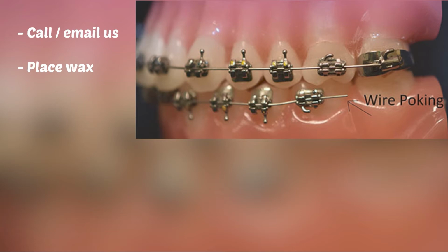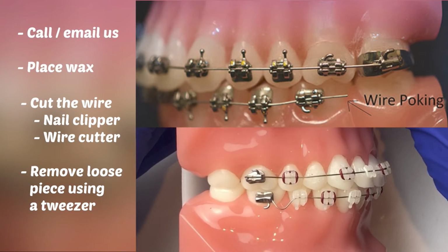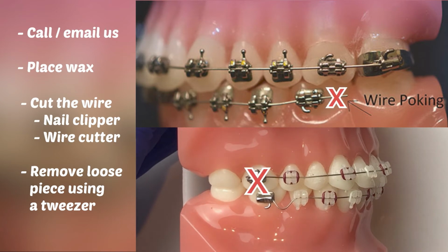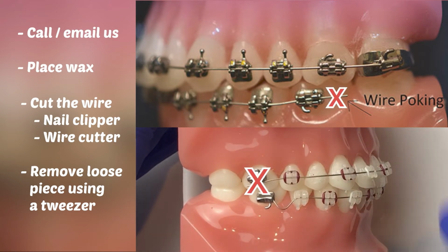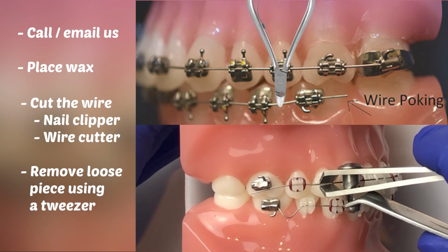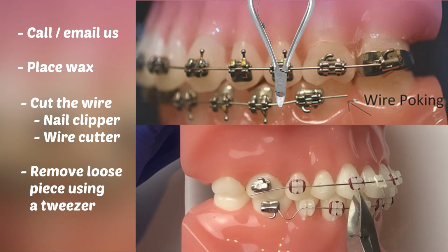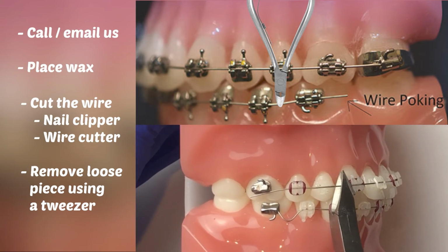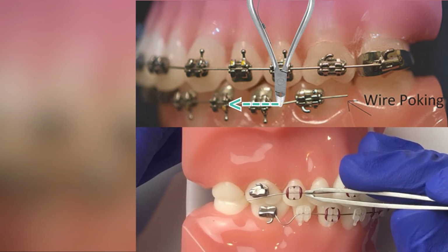If you're unable to come in and the wax doesn't seem to do the trick, an adult can also help you cut the wire using a disinfected heavy nail clipper or wire cutter. Make sure not to cut the wire near the end, but rather between 2 brackets that still have the color bands holding the wire in. This way, the back piece won't move too much since it will be held in by the color bands. And then, you can remove the back piece of wire by using a pair of tweezers to pull it forward.